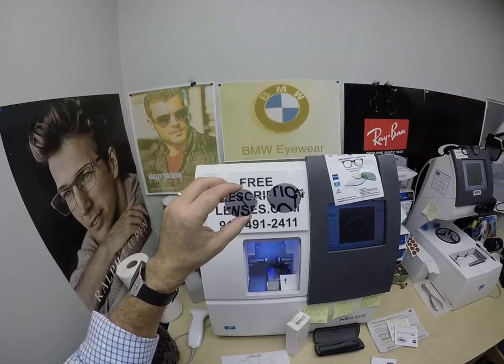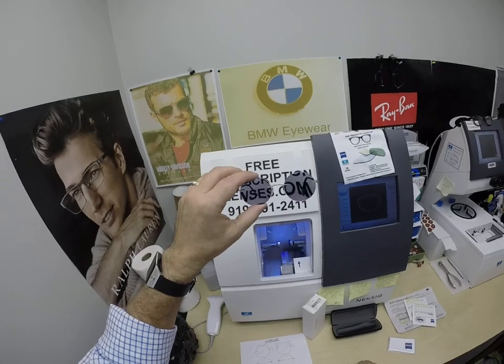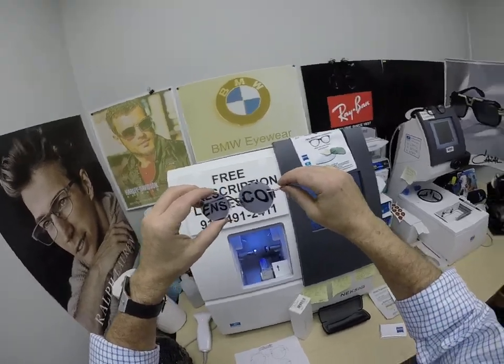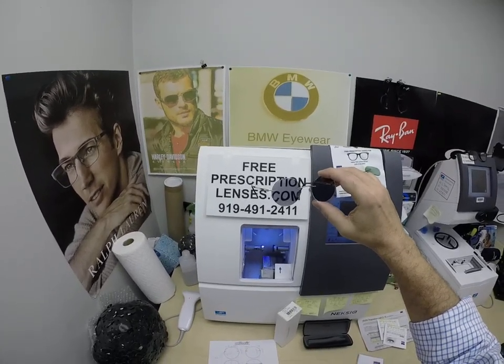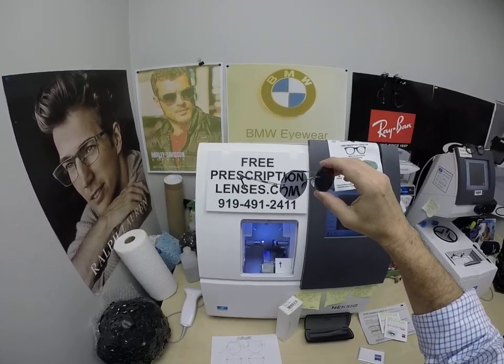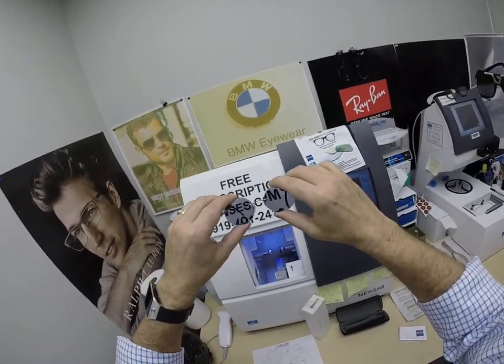The PhotoFusion Extra Gray adds $129. The PhotoFusion Gray, Brown, Green, and Blue — the blue is what I wear and you see a lot of in my videos — adds $99 to the cost of the frame. The regular PhotoFusion blocks 30% to 50% of the harmful blue light emitted from today's electronic devices.